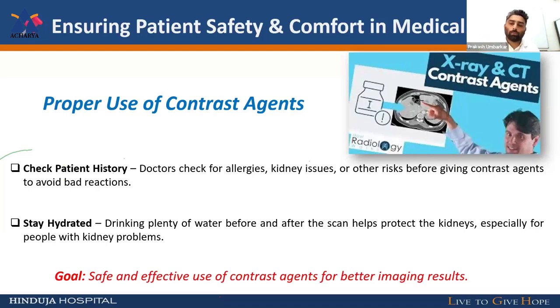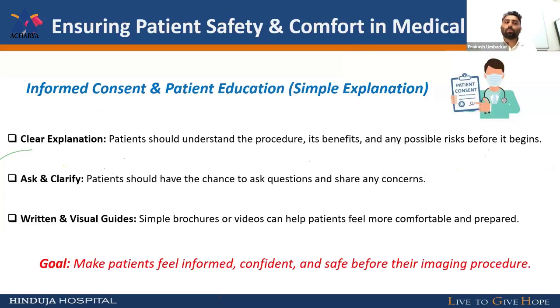They can also help the patient. That is very important for each and every person involved in the contrast agent delivery and in acquiring your CT scan imaging. Last, informed consent and patient education.